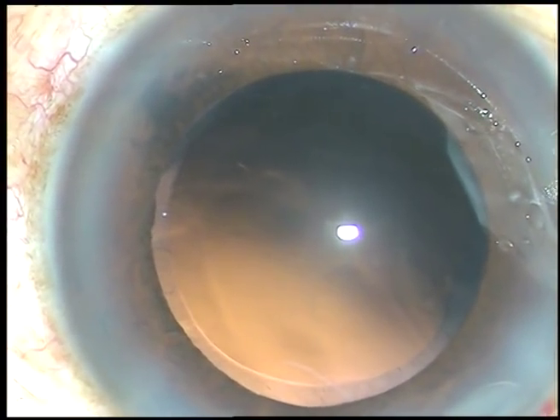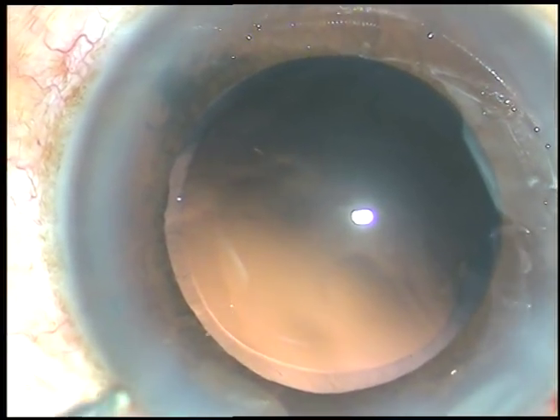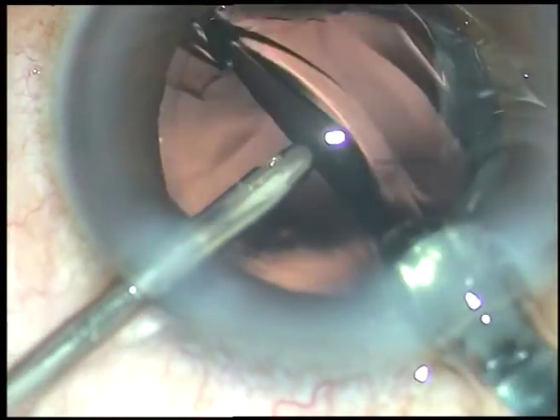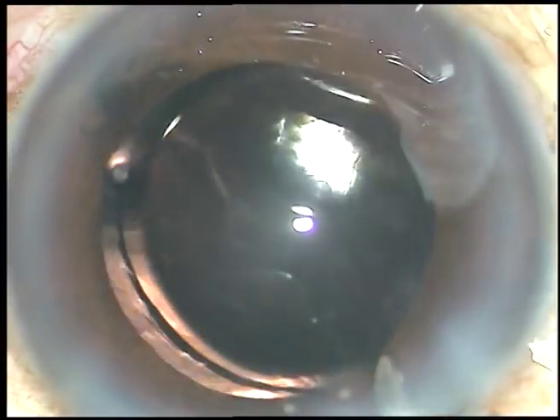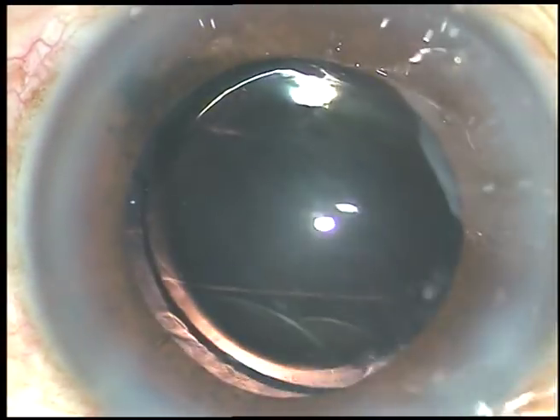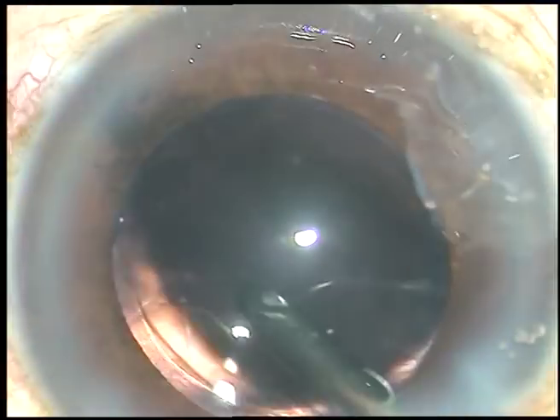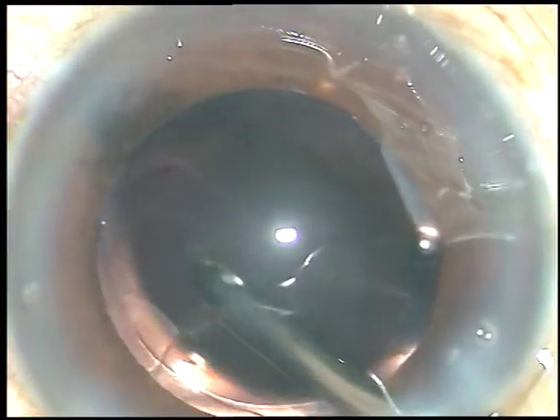And now is the time to implant an intraocular lens. What I am going to do is hydro-implantation. It means the anterior chamber is being formed by hydro, that is BSS, and the IOL is implanted in the capsular bag. The lens is dialed with the irrigating probe.